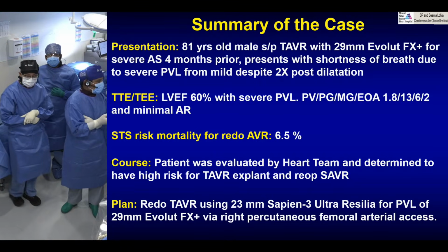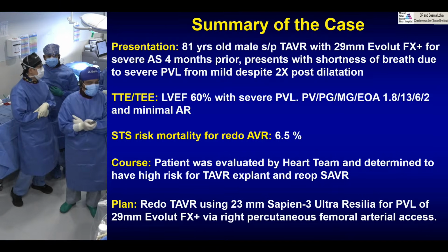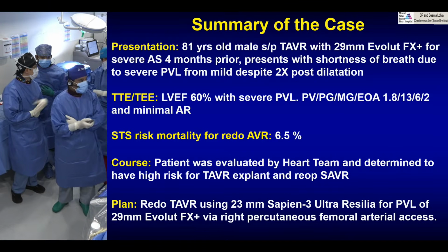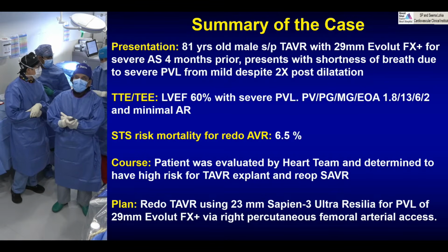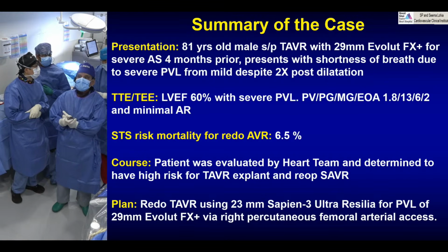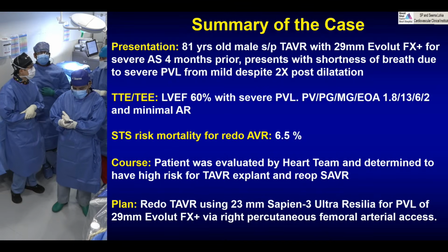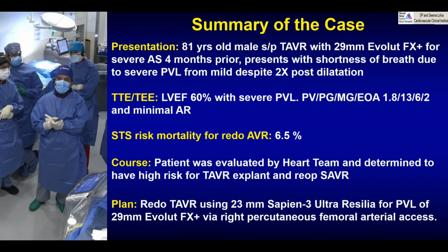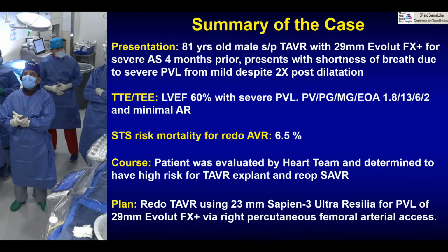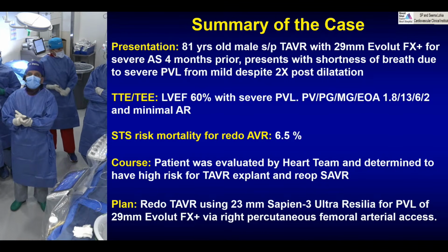Remember, it was so tough to convince these patients, when they come back, to tell them you may need another valve. I can tell you the patients I'm saying plug it, they're very angry. So, Sahil, what do you think? 26 minus or 23 plus? You have to go 26. Even then, if you need something, we need 26.